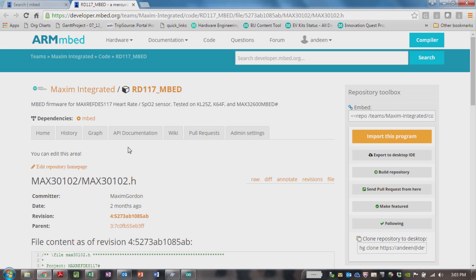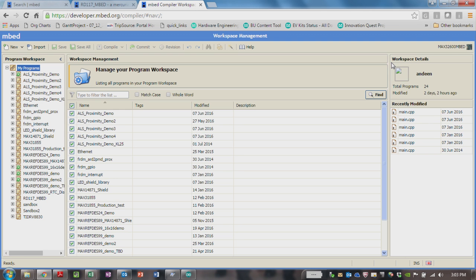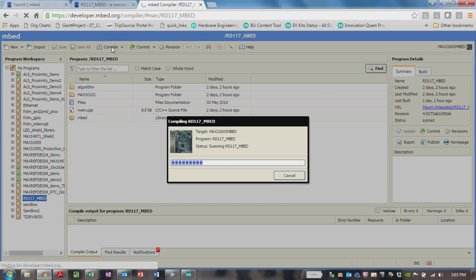Okay, perfect. Now, I've actually already preloaded this onto my compiler, so we're just going to jump over there and pull up my compiler, and I've got it right here. So up comes the embed code, and we just double check that we're on the right platform board, Max 32600 embed. So I'm going to go ahead and just compile that code and let it run a little bit.